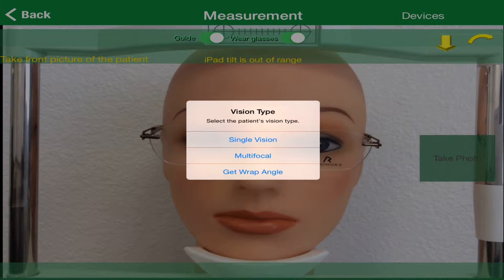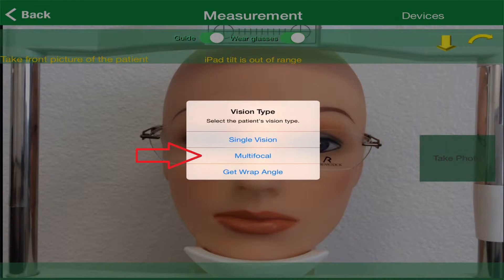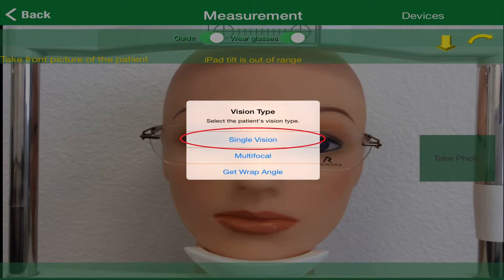Now we will need to choose the vision type of lenses that your patient will be wearing. If they are going to be wearing single vision lenses, you will touch the single vision box. If they will be wearing progressives, bifocals, or trifocals, you will touch the multifocal box. Let's start out with single vision first. Touch the single vision box and you'll be ready to begin measuring.